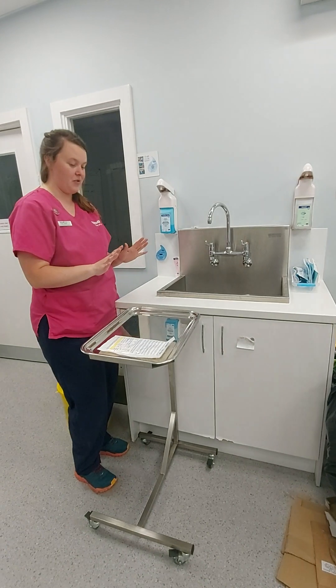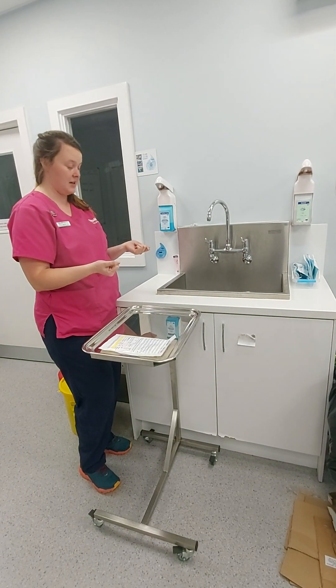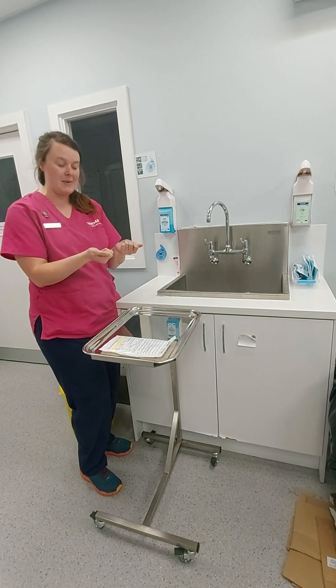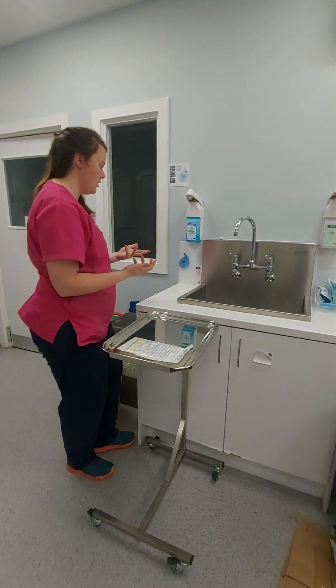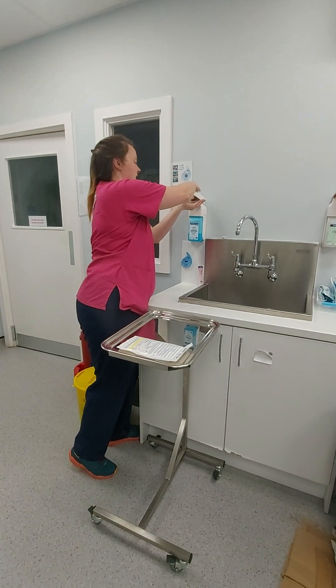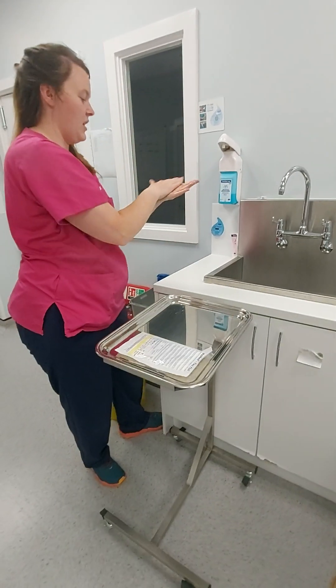So, surgical hand prep — you need to complete a surgical hand preparation using sterillium. You will be hot, you will be clammy, so you will burn off the sterillium quite quickly in the exam. So don't worry if you do, but obviously initially we're going to take a good quantity to start and then start our timer.